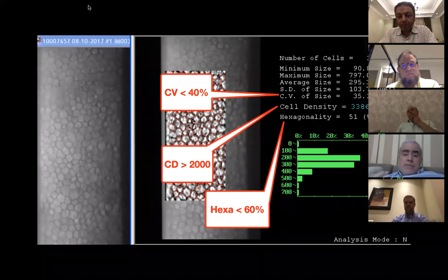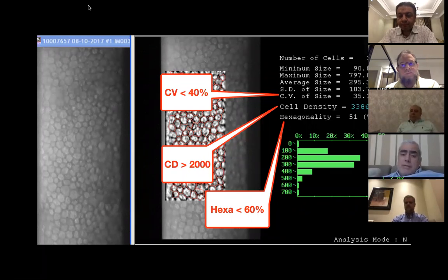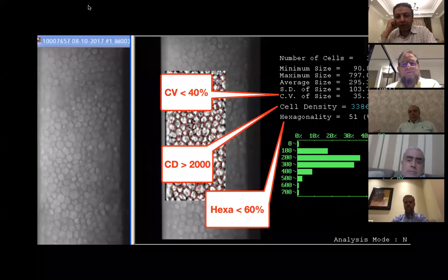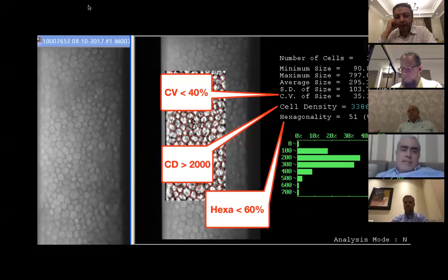This is very important, and I really appreciate that you have put these tricky parameters to let us be careful before entering the anterior chamber. Yes, we have to calculate that before going to intraocular surgery. If you are an excellent phaco surgeon, by just entering the anterior chamber, you will lose 500 cell density, and the other parameters will drop dramatically.